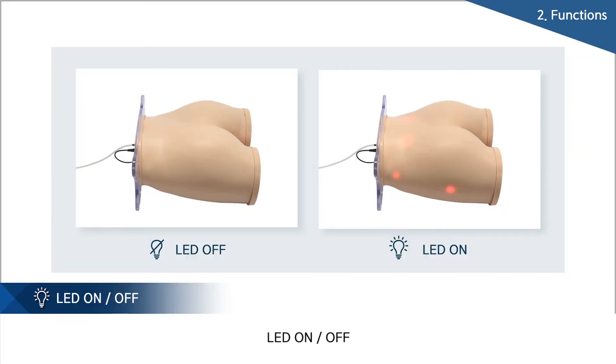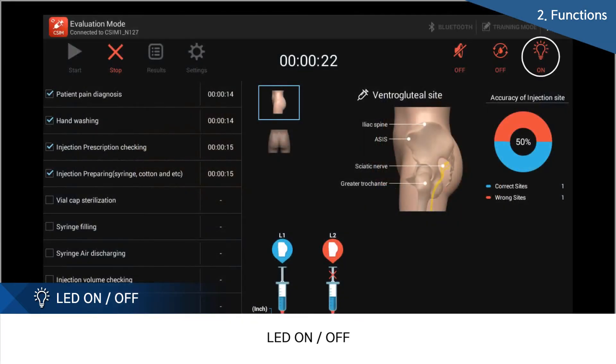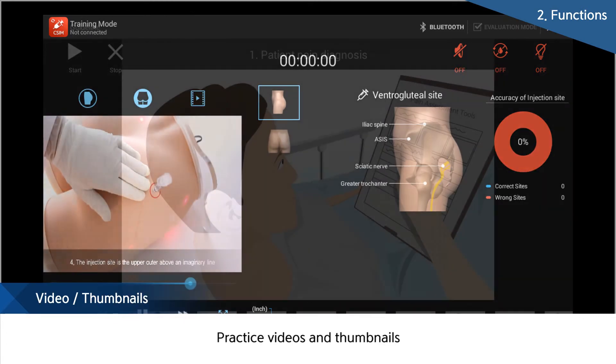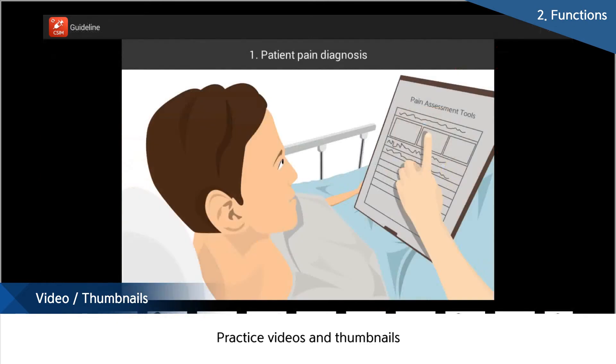There is an LED light guiding positions of bones, helping beginners understand the exact injection position. The LED lights can be turned on and off depending on the training. Educational video and animation film following the injection training procedure are also provided.